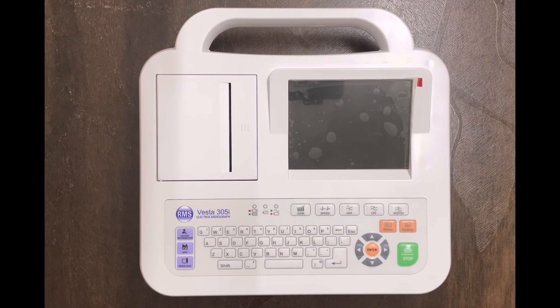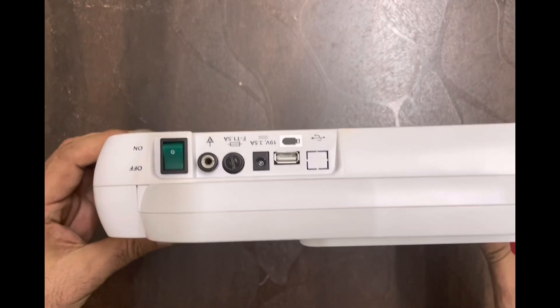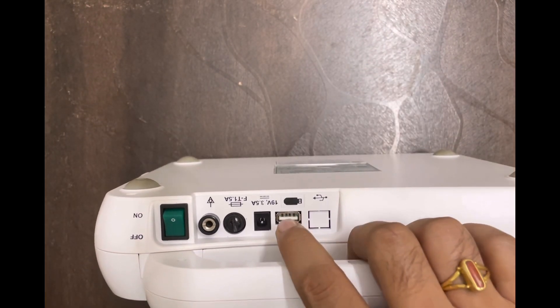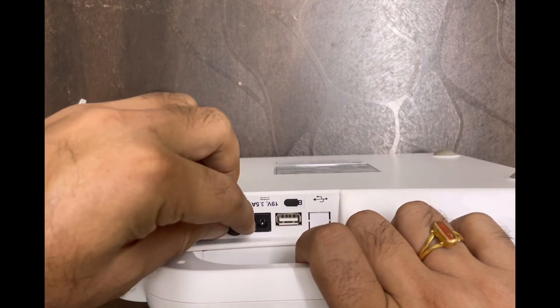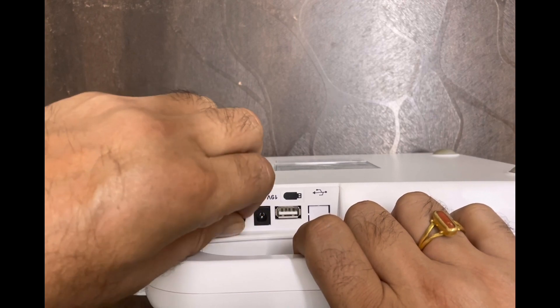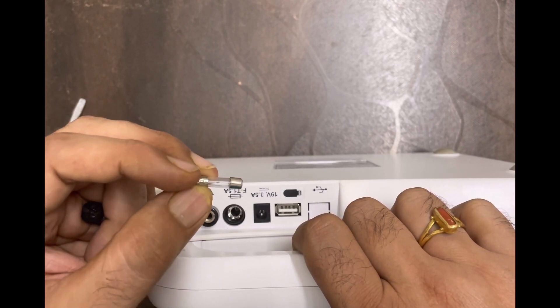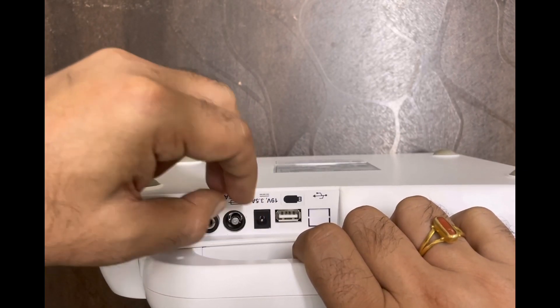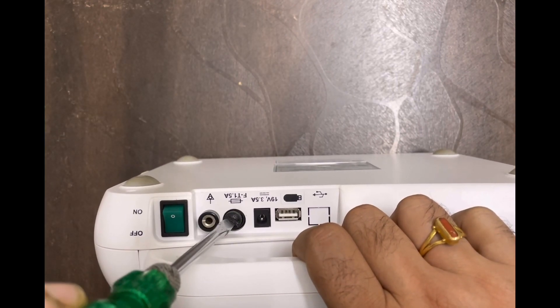Let us start the installation. First, we will fix the fuse, then enter the clinic information, and then do the ECG roll setup. For fixing the fuse, go to the back side of the machine, below the handle, and you will find a black color minus button. Unscrew this button with a screwdriver, then take one fuse from the ECG charger box and insert it inside the machine.